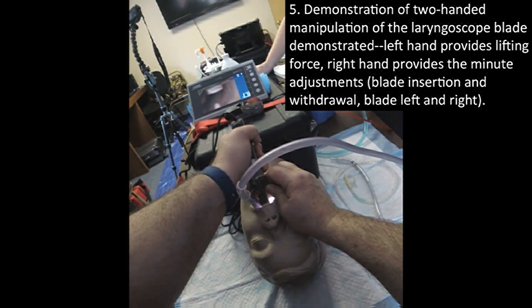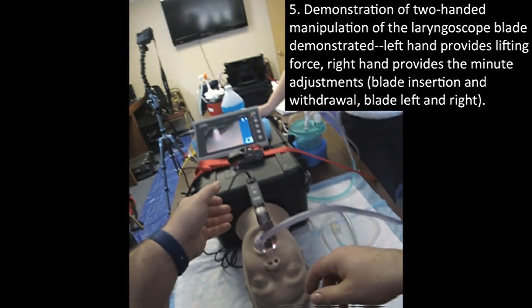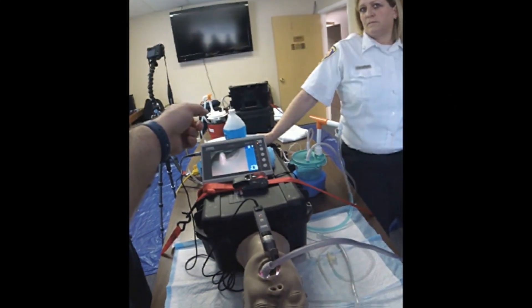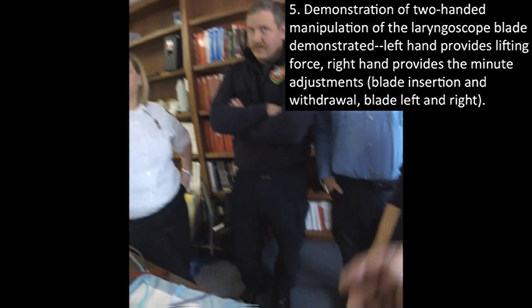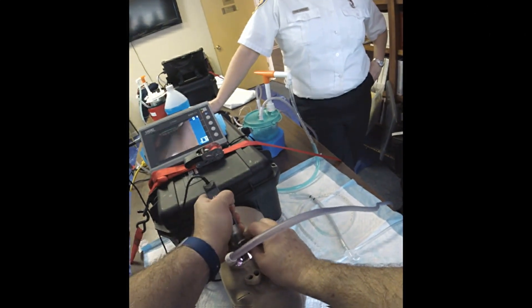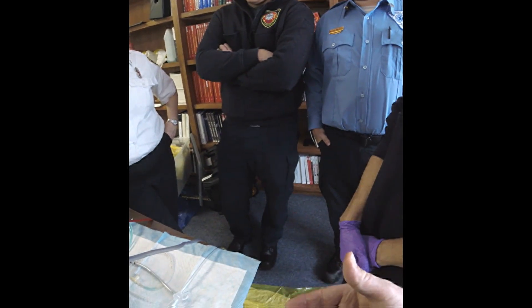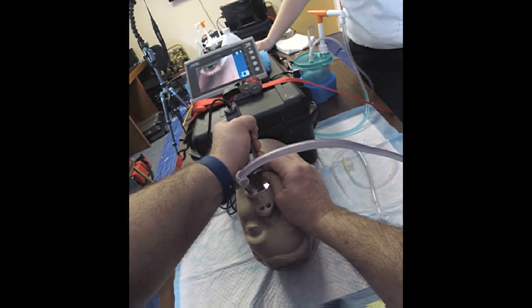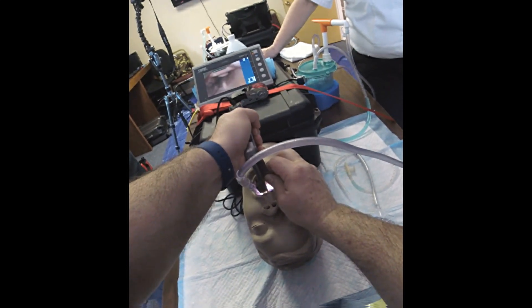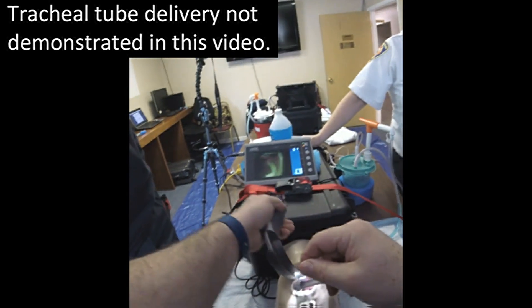Watch the screen — I can move it in and out. It's very difficult to move it in and out with the left hand, because when you lift something as heavy as that gallon of windshield wiper fluid, you can't make small changes. The right hand can make tiny adjustments. See — isn't that a great view of the larynx? I can't intubate that because I've crowded it and there's no room for tube delivery. What I need to do is pinch the laryngoscope, hold this with a little less tension, and back it out with the right two pincer fingers. This is how you're going to handle these video laryngoscopes.